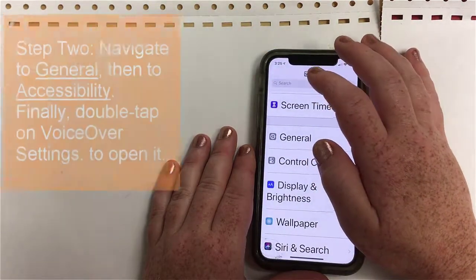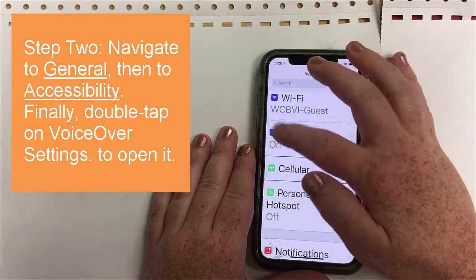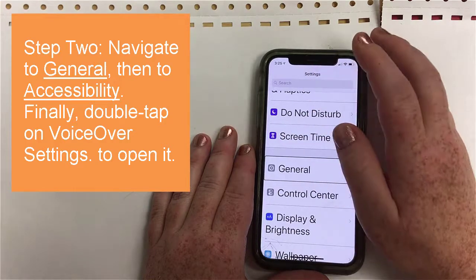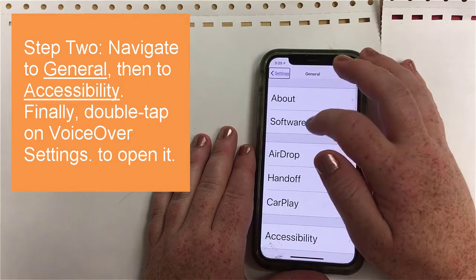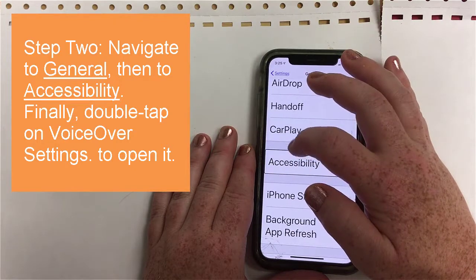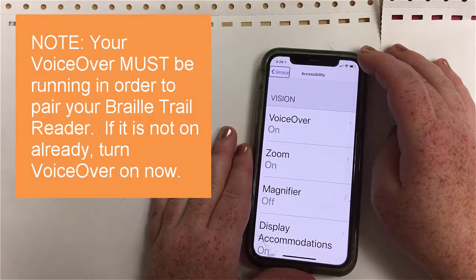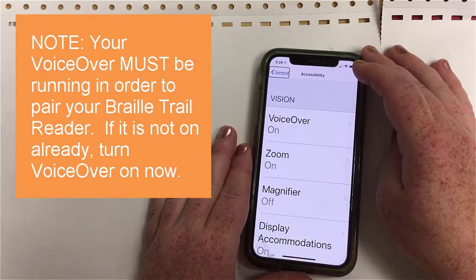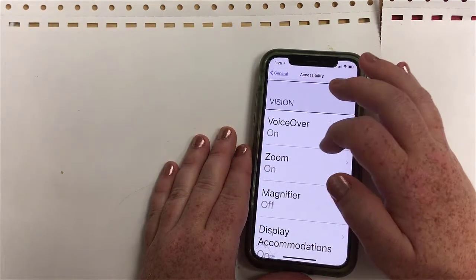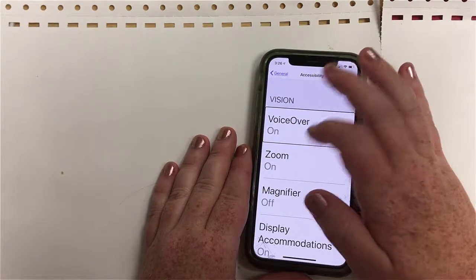I'm opening Settings. In order to get to the VoiceOver settings, I'm going to go to General, then Accessibility. Please remember that your VoiceOver must be running in order for your Braille device to function. I found the VoiceOver settings and I'm going to enter that by double tapping.